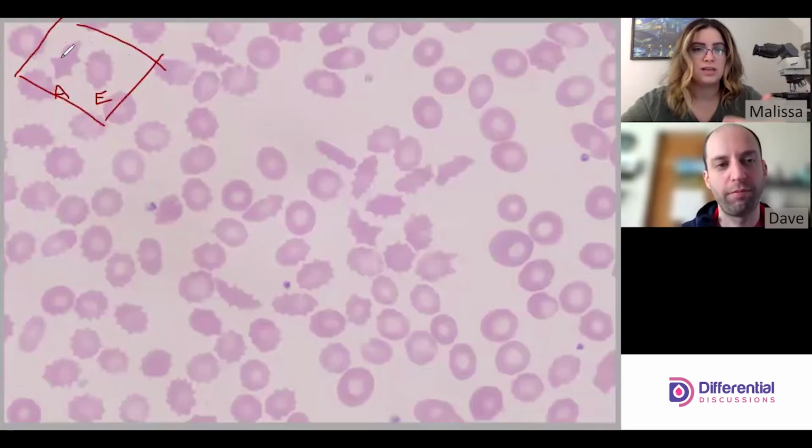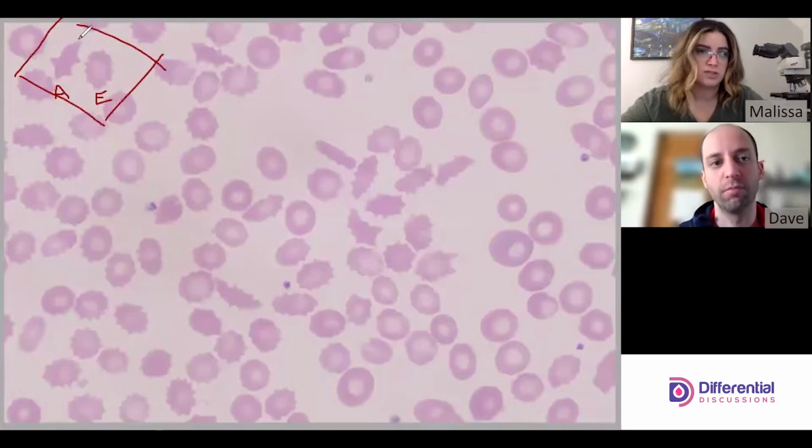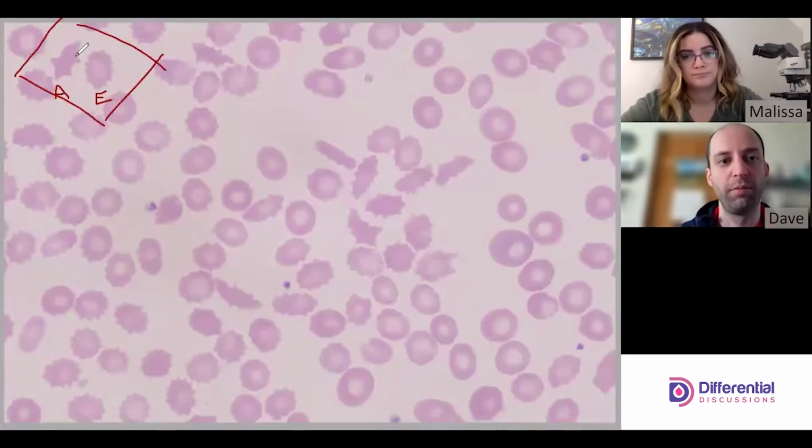Notice they're not even all the way around. You have a small gap here, but a slightly larger gap here in between the spikes. Then you have this slightly undulated area with very small spikes, and then back to the spikes and flat areas. It's a good juxtaposition of the two types of morph.